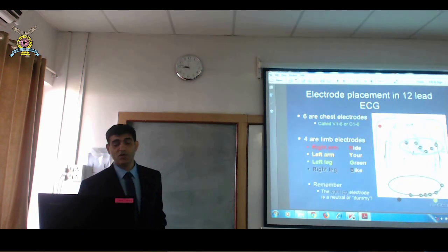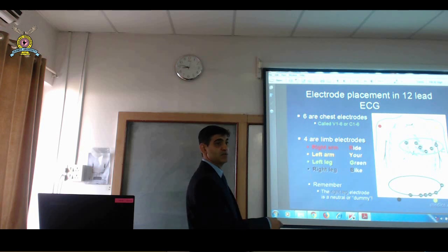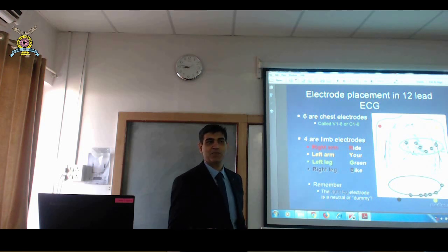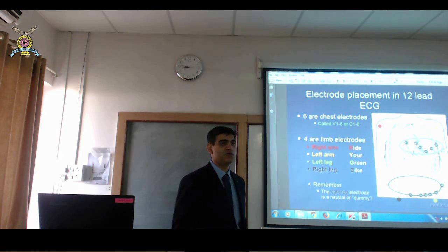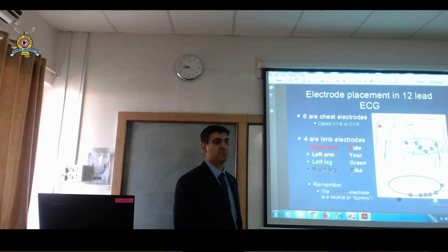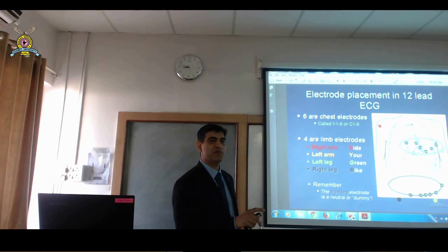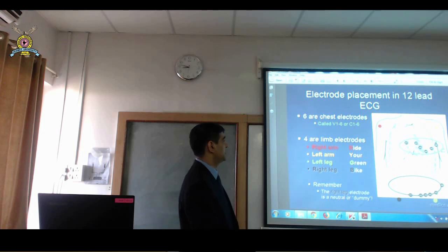Now, there are other leads which people can do. We can continue going backwards. V7, V8, V9, just continue wrapping backwards. Personally, I don't see much reason. In the last 10, 15 years that I'm practicing cardiology, I don't have to even do this, except out of academic interest. How many of you have done ECG with V7, V8, V9? It's not required. I'll tell you the reason when we're interpreting ECG. Because you can find the same information by looking at the front side. And that's why I'm not using V7, V8, V9.